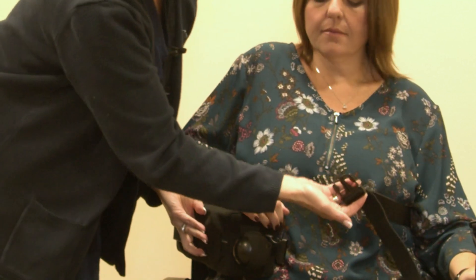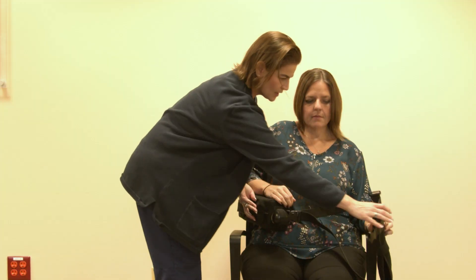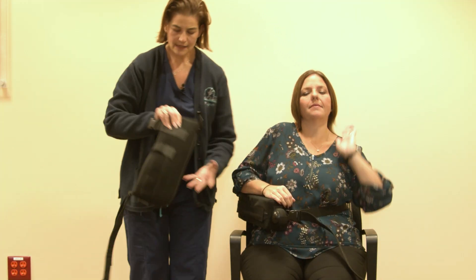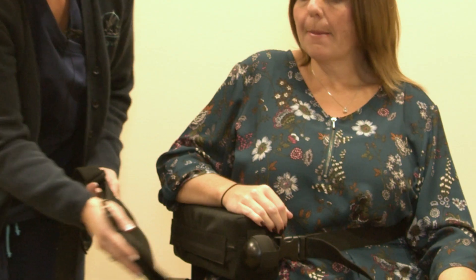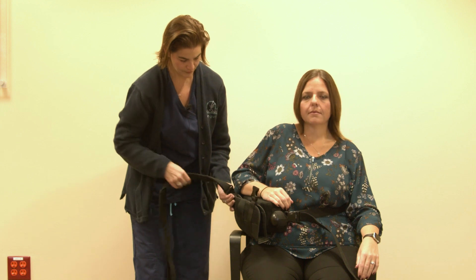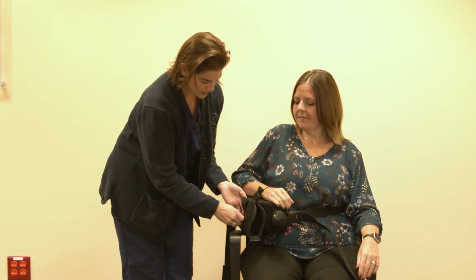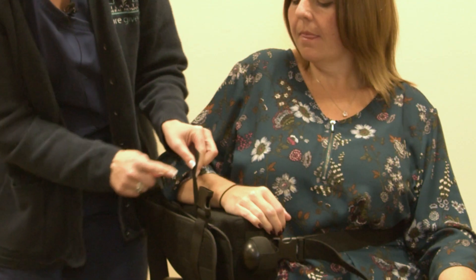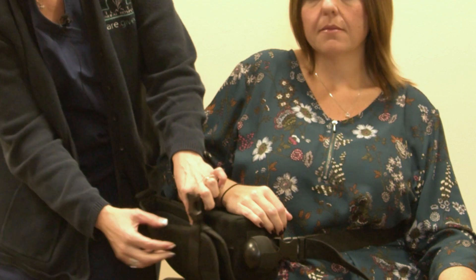And this will clip here in the front. The sling has Velcro that attaches to the outside of the pillow. I'm going to undo this short strap to allow the opening for her arm to go in.